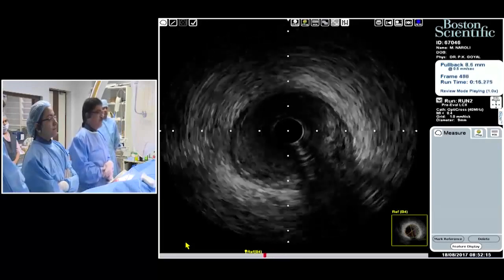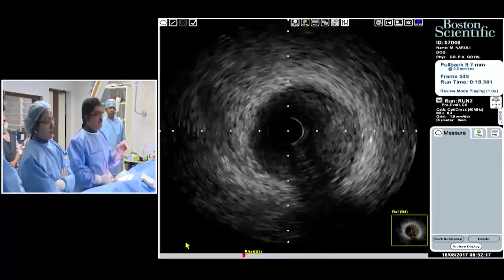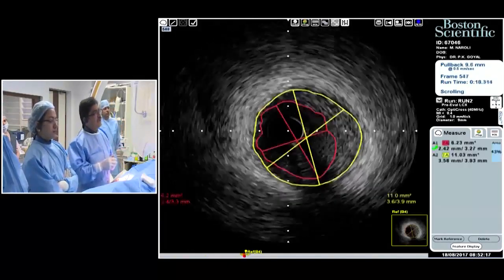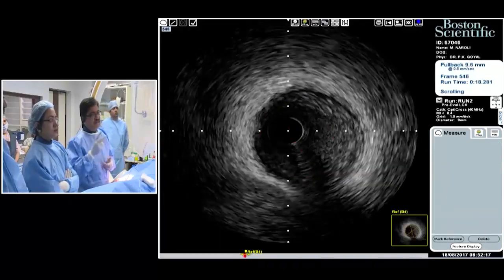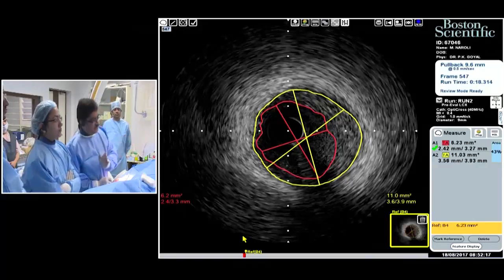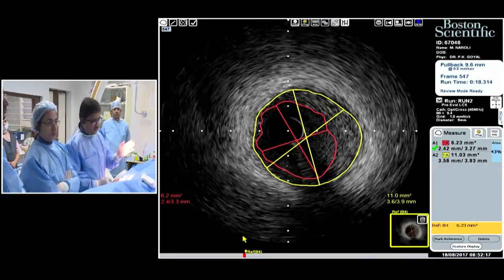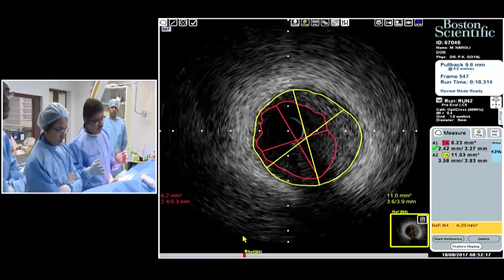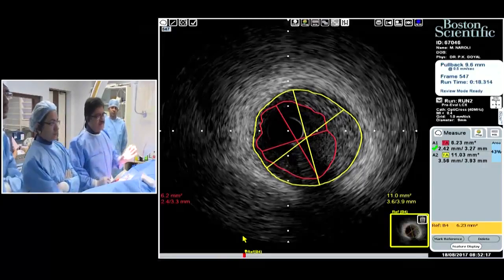Here, I think very few cases have a left main that is so small. Anyway, you need to cover only if there is an ostial lesion. Here, I think anyway you need to come into the ostium, because it's a very short left main. Even otherwise, there are two things that I always do. Largely, I try to cover the left main ostium, the LAD ostium. Means I always have a crossing. Just restricting it to the left main is not very easy.